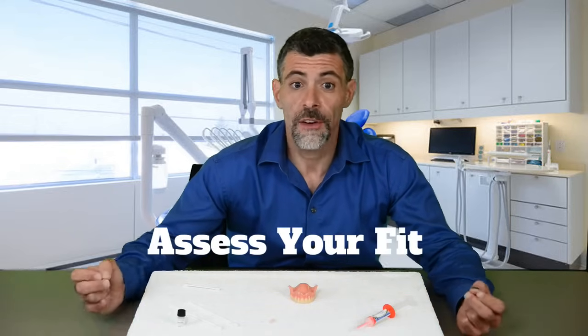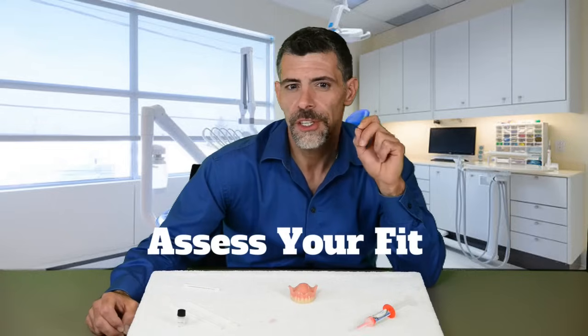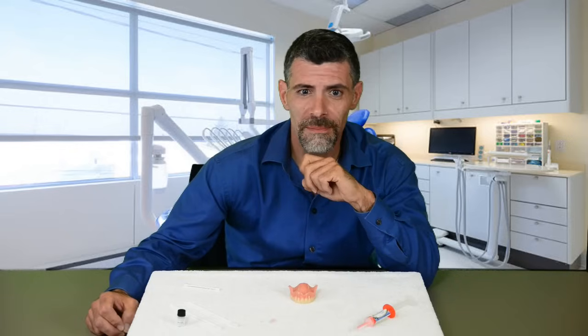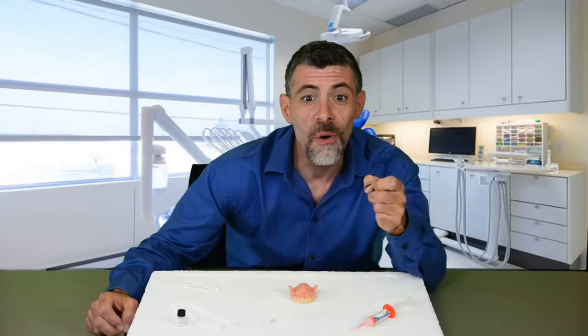Now let's assess our fit. With your denture still in your mouth, try to feel if it is snug. Take your denture out of your mouth and pay attention to whether you have any suction. If your denture is snug, congratulations — you are done! It is best to leave your denture out of your mouth for the next two hours while the silicone finishes its curing.